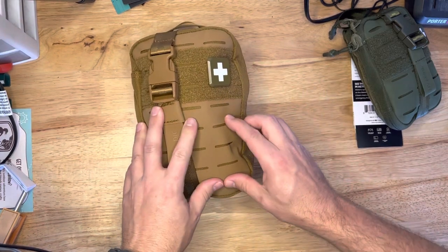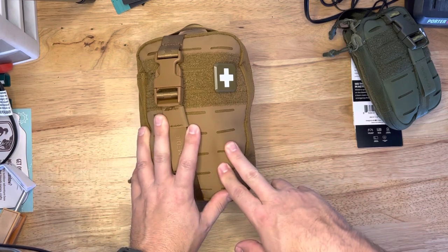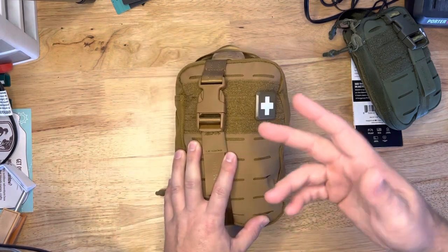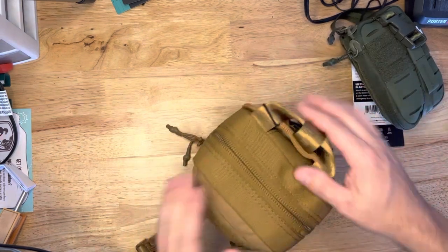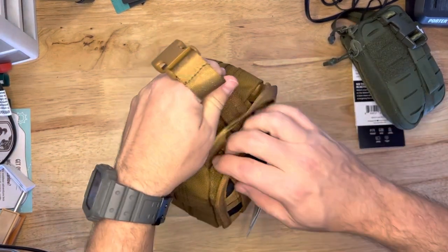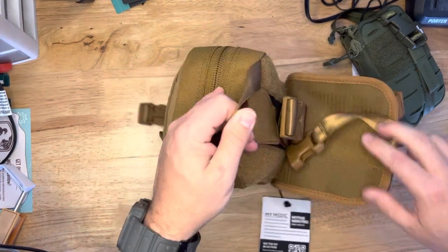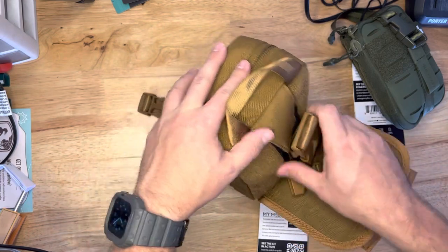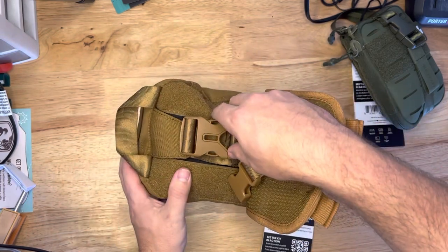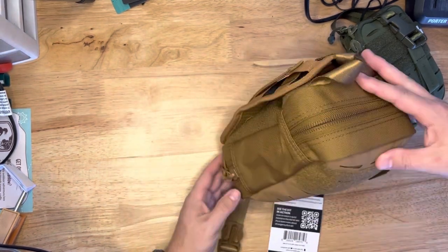One thing I'm going to notice right away is that they have this laser-cut MOLLE on the outside, versus the old-school style that they had — the regular MOLLE. So that's a big improvement right there from the get-go. Same kind of strap, same rip-away design here with the Velcro on the back. What's cool though is they've actually got a strap back here that's kind of Velcroed and hidden if you don't want to use it like a shoulder strap. That's kind of cool too.